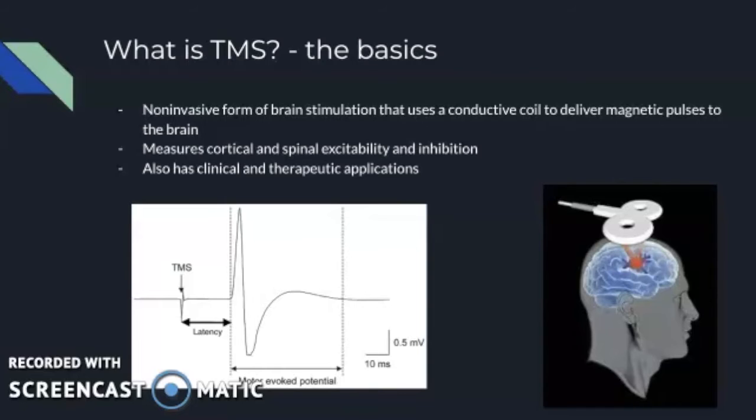It's typically applied to the motor cortex, but theoretically it can be applied to other parts of the brain, such as the cerebellum, or even other parts of the body, such as the forearm. In TMS literature, researchers often deliver a pulse and simultaneously measure a motor-evoked potential using electromyography. A motor-evoked potential is a neuronal electrical signal that can be measured using an EMG electrode.